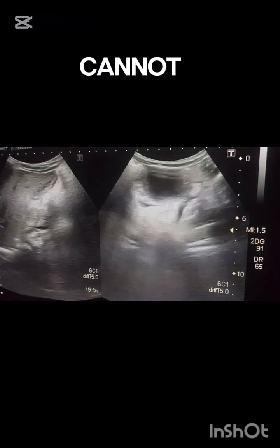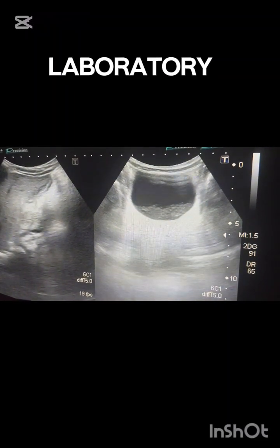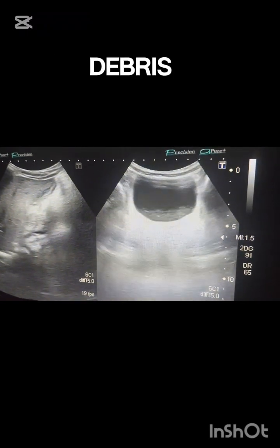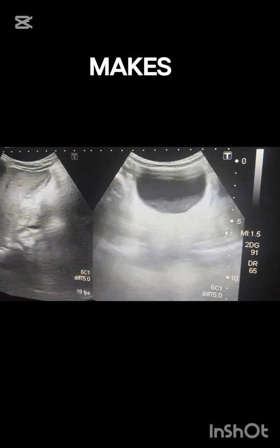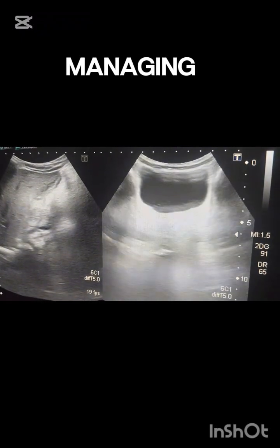Although ultrasound cannot definitively diagnose cystitis without clinical and laboratory correlation, its findings such as wall thickening, luminal debris, and irregular mucosa provide strong supportive evidence in suspected cases. This makes ultrasonography a valuable adjunct in diagnosing and managing cystitis.